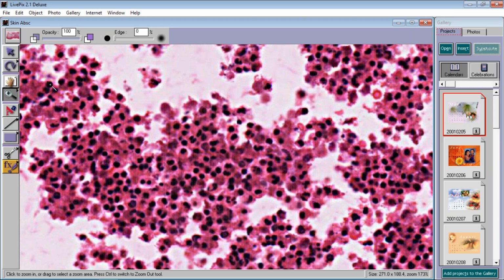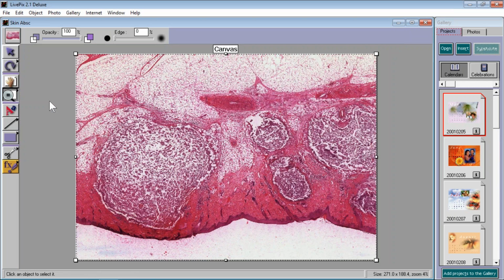We're not going to theorize what caused these or what it might be secondary to. From a very honest point of view, you could say you have a skin in which you have multiple abscesses in the dermis and almost extending to the epidermis even. That thing could rupture and drain through the skin. You might put a needle through here just to drain that pus.